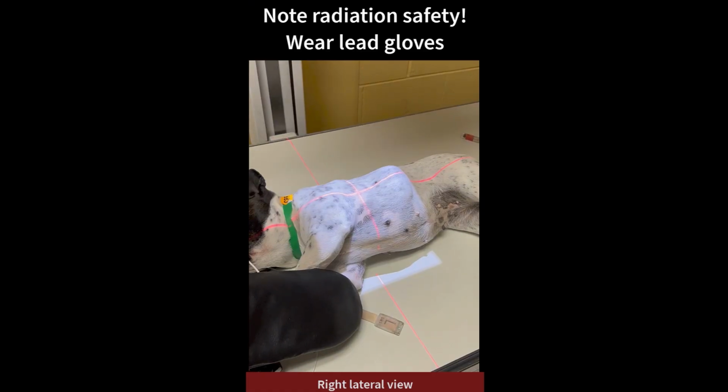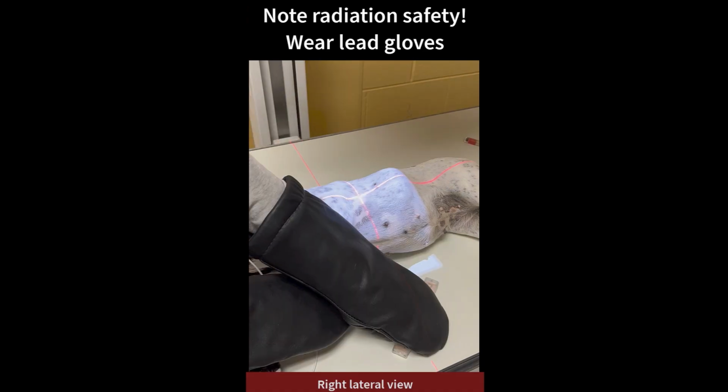Remember, the hands of staff involved in patient restraint should be outside of the collimated field of view, also known as primary beam, and appropriate shielding with lead gloves, aprons, thyroid protectors, and/or goggles should be worn by anyone remaining within the room. If possible, positioning devices, such as sandbags or tape, may be used to restrain the patient as an alternative to physical restraint by staff.